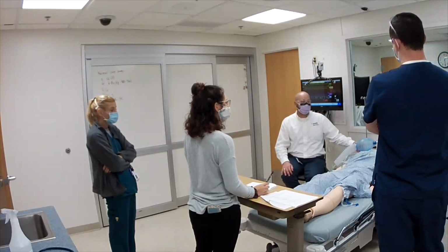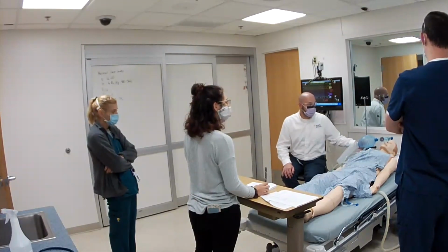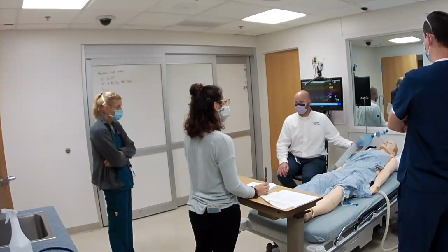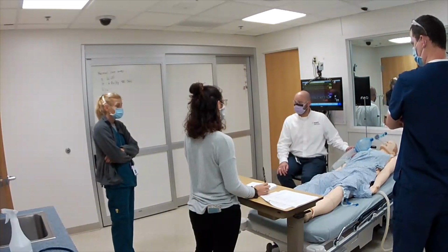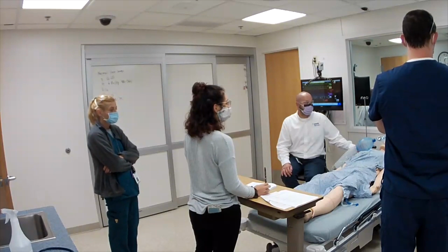Okay, my hands get tired, so let's go ahead and hook him up here. Get carpal tunnel. Setting this. Alright. So have him on there. Is he happy? He looks to be so far. Okay, good.